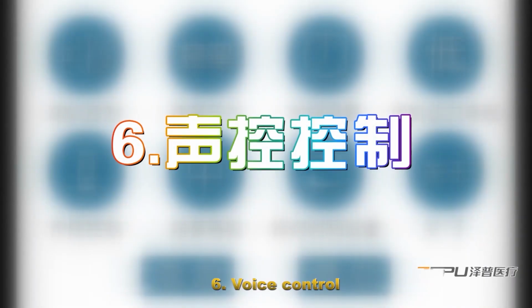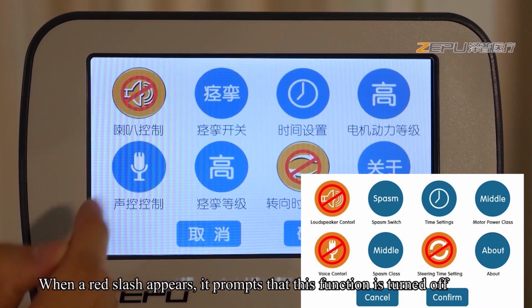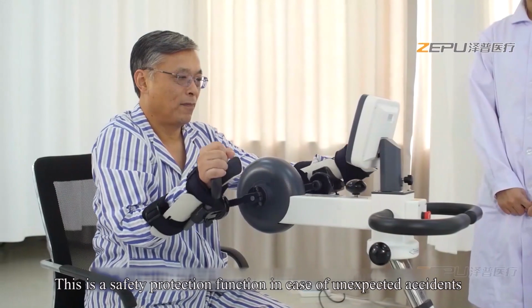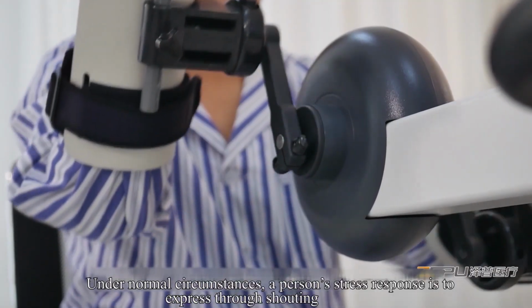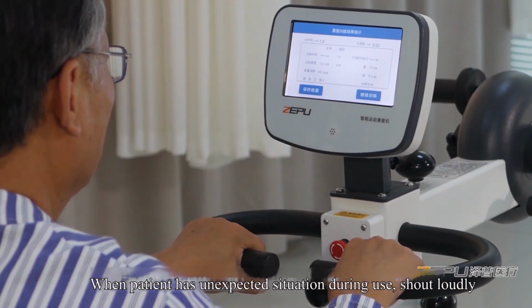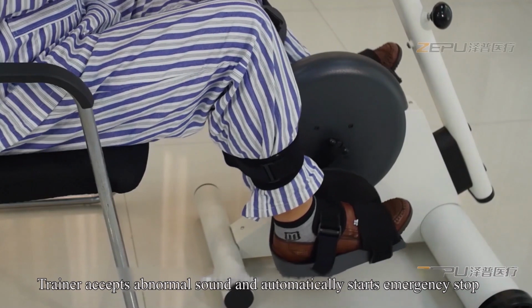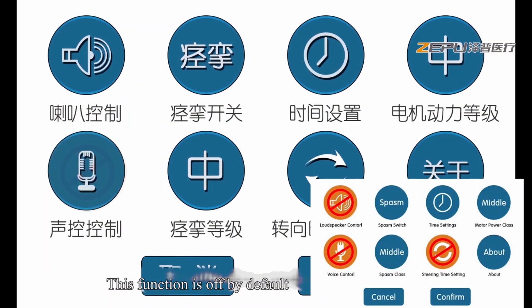6. Voice control. Click Voice control. When a red slash appears, it prompts that this function is turned off. This is a safety protection function in case of unexpected accidents. Under normal circumstances, a person's stress response is to express through shouting. When patient has unexpected situation during use, shout loudly. Trainer accepts abnormal sound and automatically starts the stop. This function is off by default. Can be set as required.